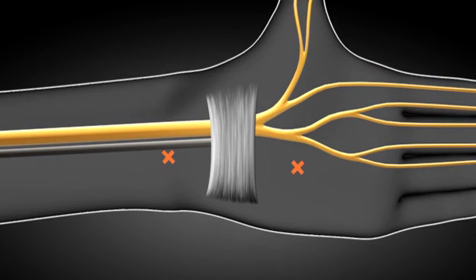The entry and exit points are marked for the access cannula assembly and carpal tunnel release blade with a sterile marker. Both points should be in line with the middle of the ring finger. The entry point for the access cannula assembly should be just proximal to the flexion crease of the wrist and ulnar to the palmaris longus. The exit point for the carpal tunnel release blade in the palm should be just distal to the transverse carpal ligament.